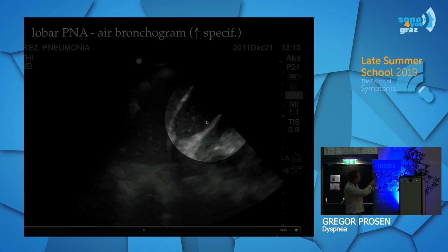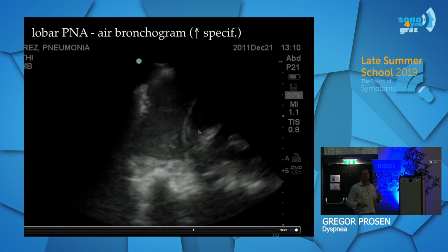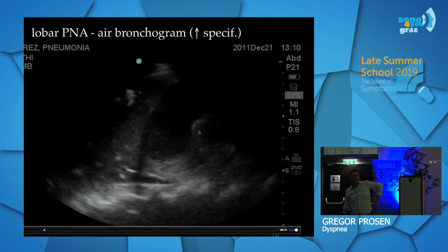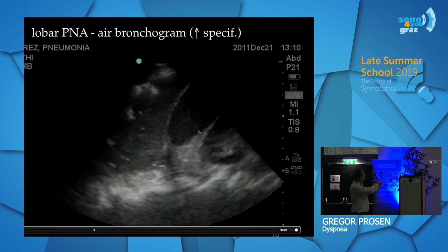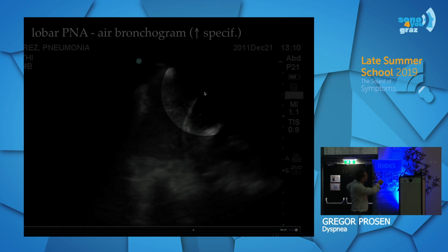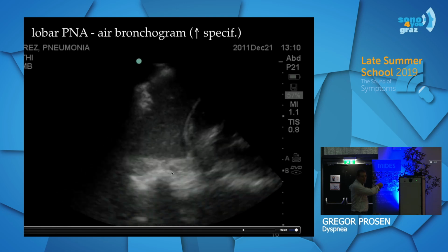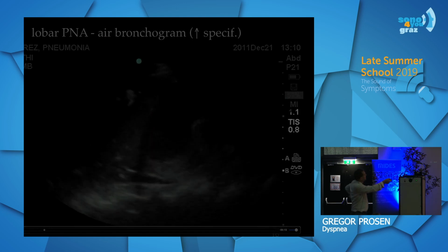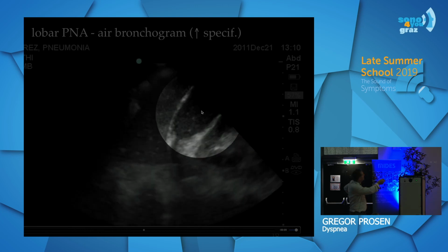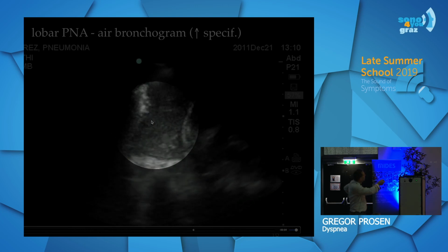This one here. What do you think? That was actually spleen. Okay? That was spleen. This line here is diaphragm. Yeah? So this is abdomen, this is thorax. So this is above diaphragm, all this structure.